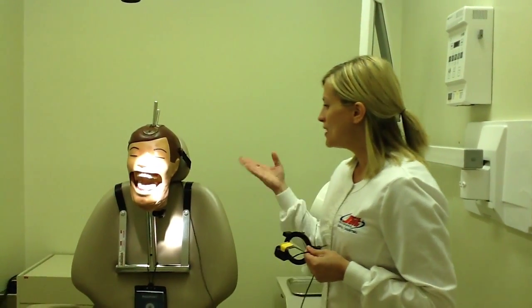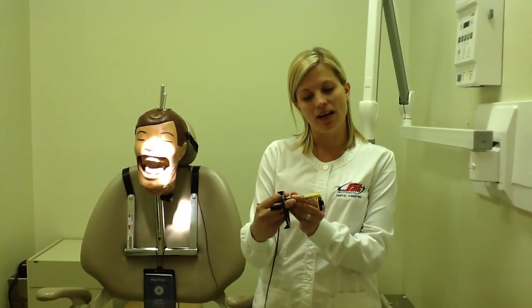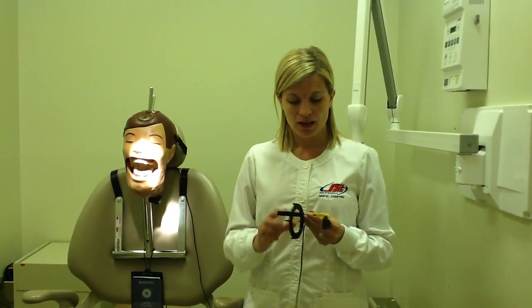Today we'll be discussing the paralleling technique. The paralleling technique is used when exposing periapicals. So we have a Dexter demo here. We'll be using the method of the direct digital. This knowledge can be transferred through all the methods, being the traditional, the PSP, or the sensors.